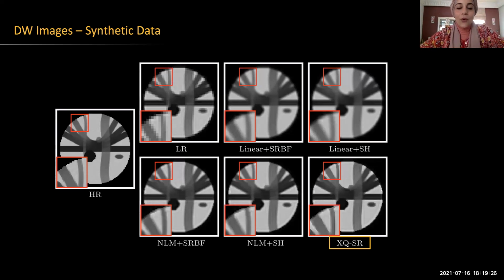Cool. Now, what are the challenges that you have faced when training neural networks on the XQ space representation of the diffusion data, in terms of hyperparameter tuning, maybe a long time of training? What are the real hands-on challenges to using graph neural networks and applying them to diffusion data?